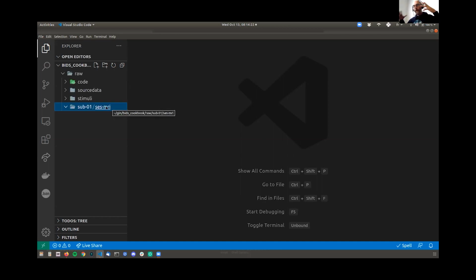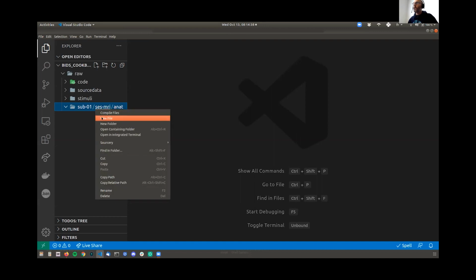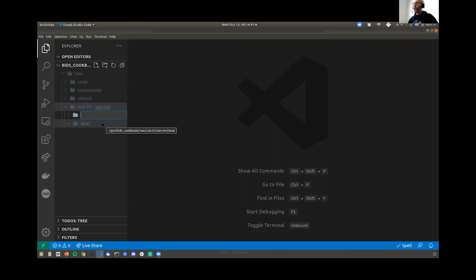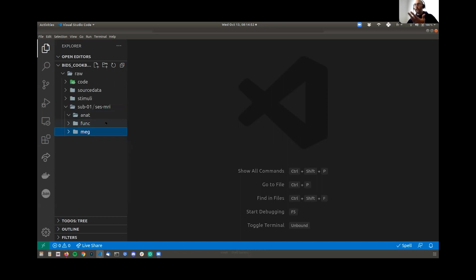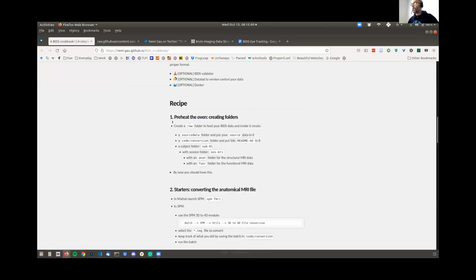Okay, and then in there, that's where you put the different folders that are going to host the data coming from different modalities, right? And so we have anatomical data in this case. So we're just going to call it anat, because that's the word we use in BIDS for anything that's structural data. Then we have another one for BOLD imaging, and that is going to go into a func, or functional data, folder. You could then have the one for MEG, and they're pretty self-explanatory, but each type of data is going to go into one of those folders. Okay, so we have our folders.